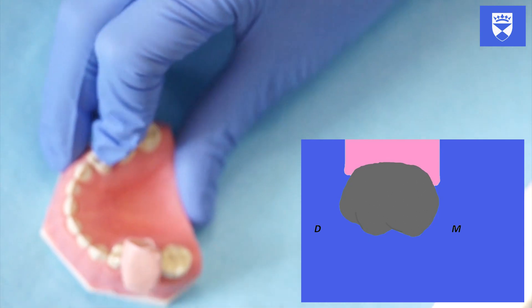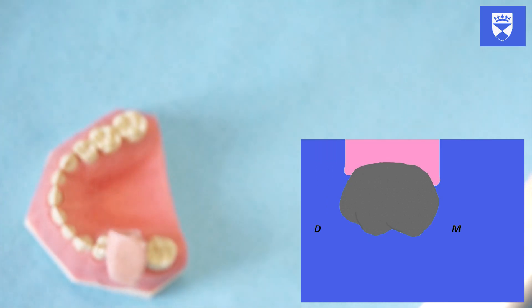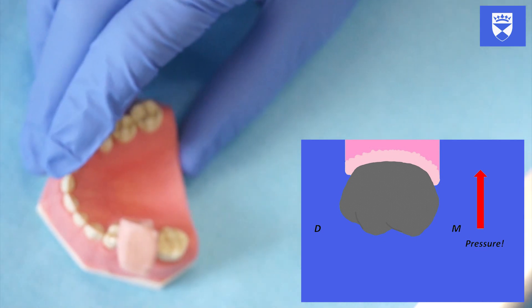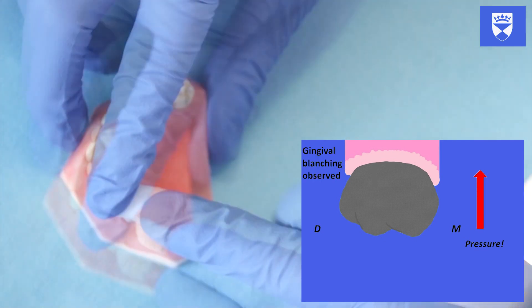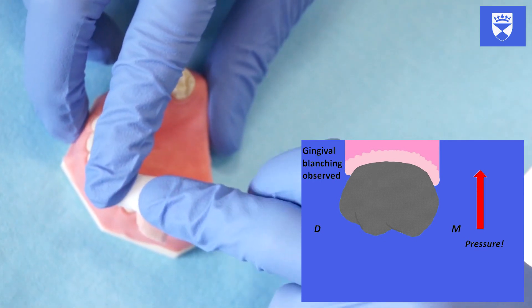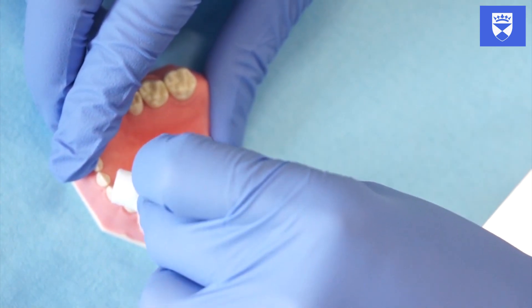Instruct the patient to bite once more or push down on the crown with your finger again. The crown will seat further. After a further 30 seconds to 1 minute, remove the cotton wool roll and elastoplast.